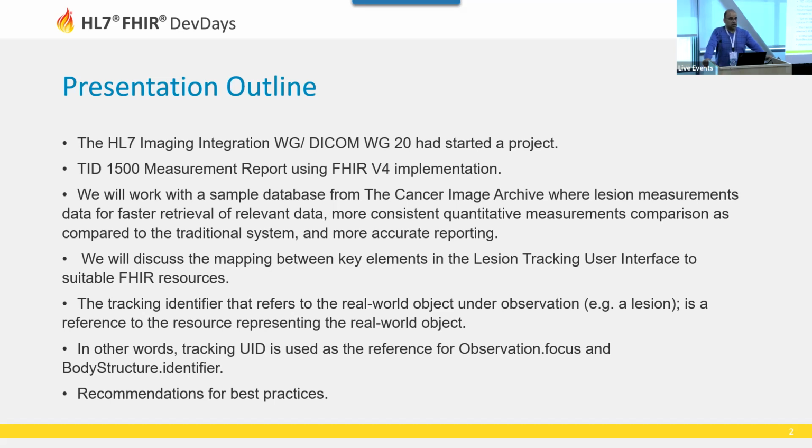It can represent observations, measurements, it can represent graphical objects, so that's why we want to talk more primarily about TID 1500.